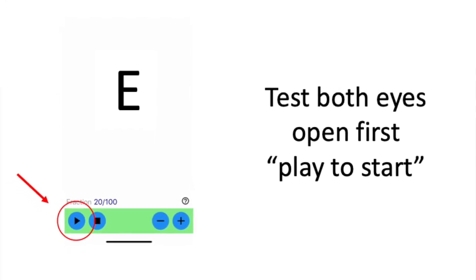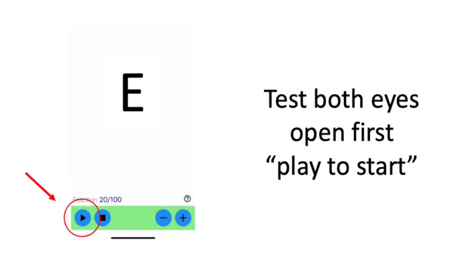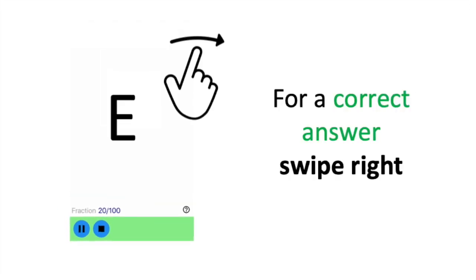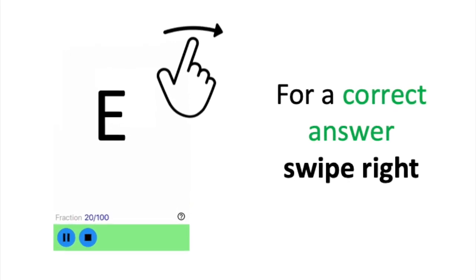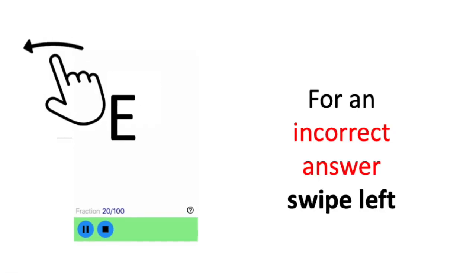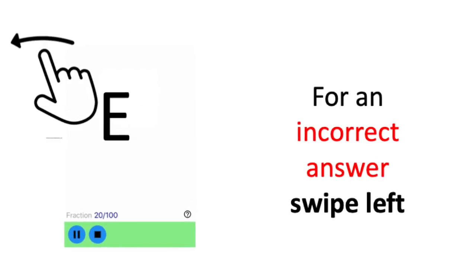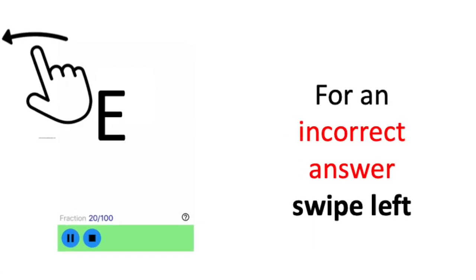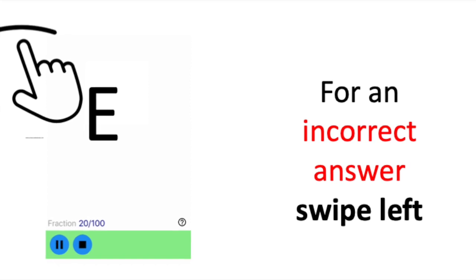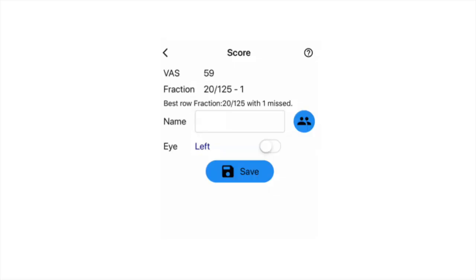Once you're ready to begin, press the play button on the bottom left of the screen. If your child gives you the correct answer, swipe the screen to the right. If the child gives you an incorrect answer, swipe the screen to the left. The visual acuity test is complete for both eyes open once the score screen pops up. Please make a note of the VAS and fraction number. Do not press the save button for both eyes open.